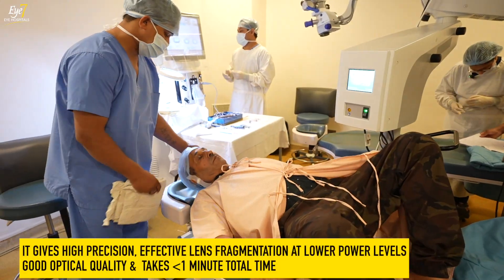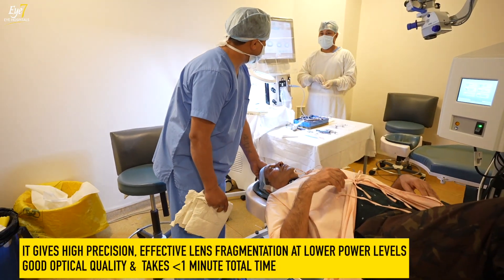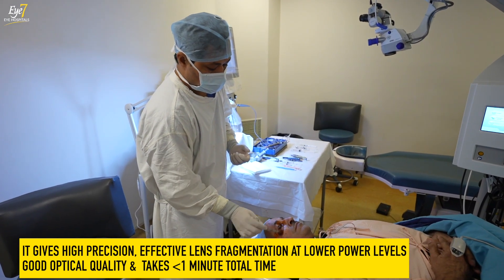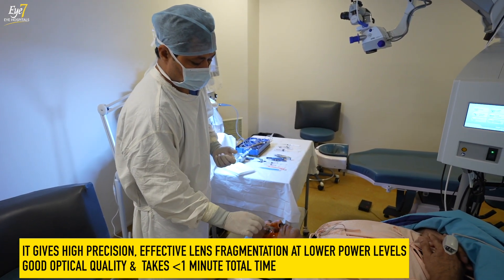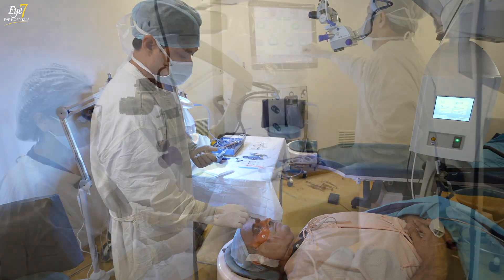When we perform manual surgery, we take these steps for at least 5 minutes. In addition, the most important thing is that the capsulotomy is perfectly centered with the femto laser.